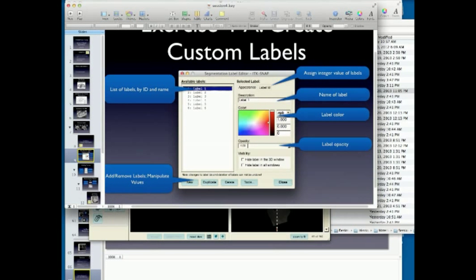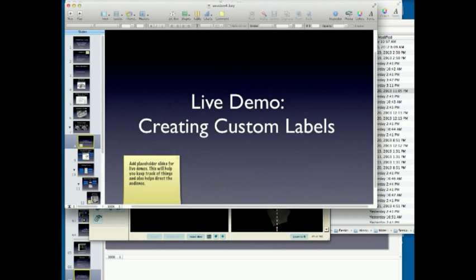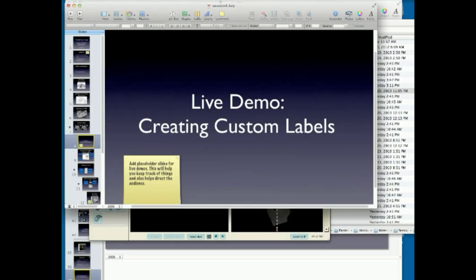So I guess I'll just quickly run through this again. So segmentation, save label descriptions, we'll give it a name. Okay. So now we save the label file. So before we move on, you can look at exercise, the first exercise in session four, and try to replicate this and create your own custom label. And you'll use that for the next exercises. So just take five minutes to do that. And let me know if you need any help.